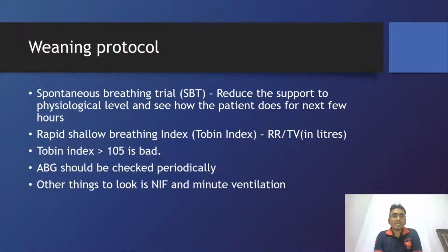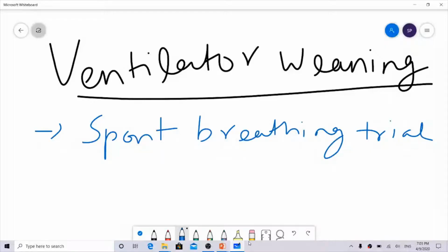Then we have something known as the weaning protocol. The first thing we do is a spontaneous breathing trial. I'll explain what this is. In a ventilator, you have all seen that the patient is getting some kind of support in the sense of pressure or volume.